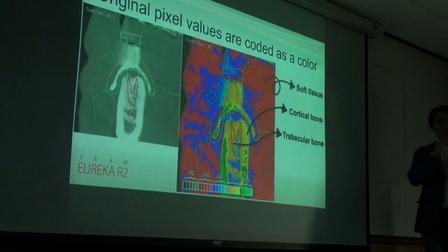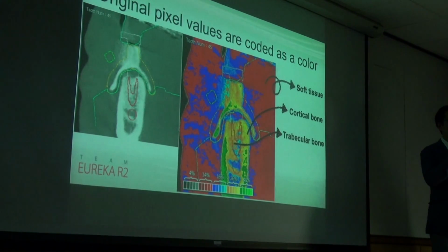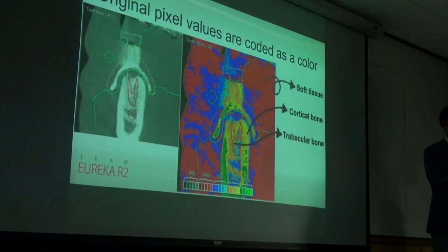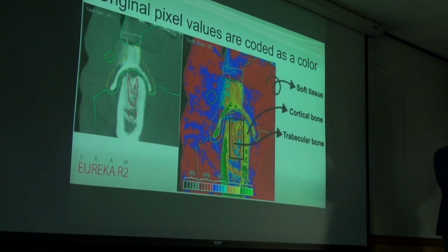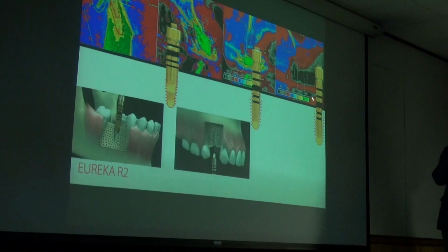So when we're using the taper implant and we meet dense bone, we have to prepare almost the same as the outline of the implant. It's a very important thing. After that, if we obtain a high initial stability, we can do immediate loading. So this color code system is very intuitive. So the real strategy is very simple.